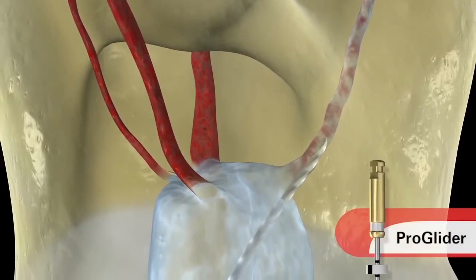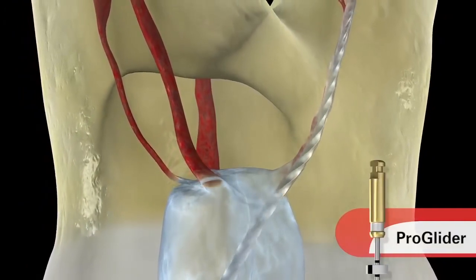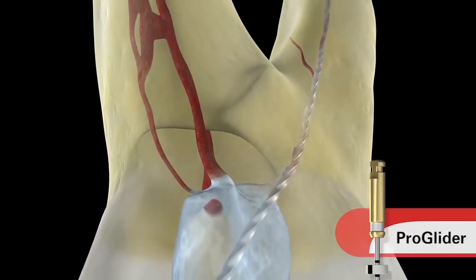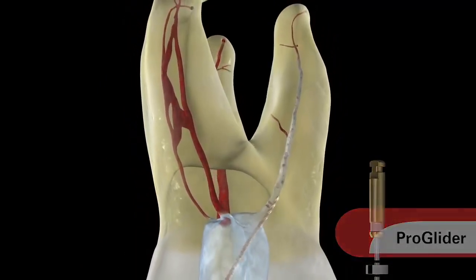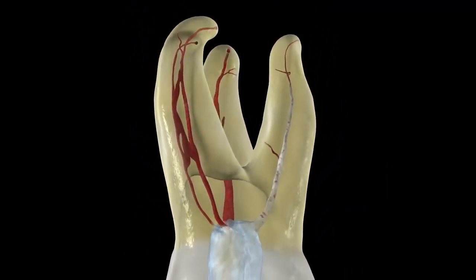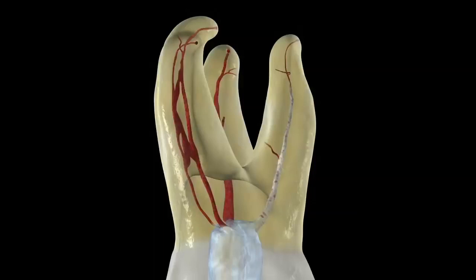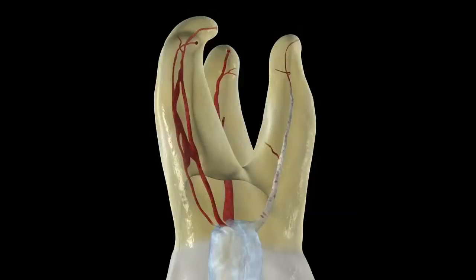Irrigate with sodium hypochlorite and remove all your viscous chelator. Never spin a file at 300 RPMs in a canal loaded with viscous chelator. The ProGlider is allowed to float, follow, and run into the canal. In literally two, three, four seconds, you will reach the level where the 10 file was, and you've expanded the shape considerably at this moment of treatment. Notice, however, there's still an awkward triangle of dentin, and the canal is still badly underprepared — but we have a glide path. That's what we're talking about: a glide path to accommodate passively and safely the mechanical shaping files.